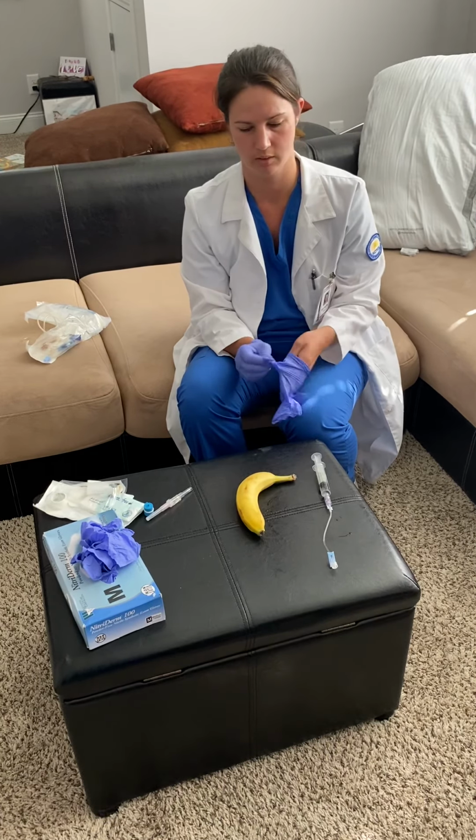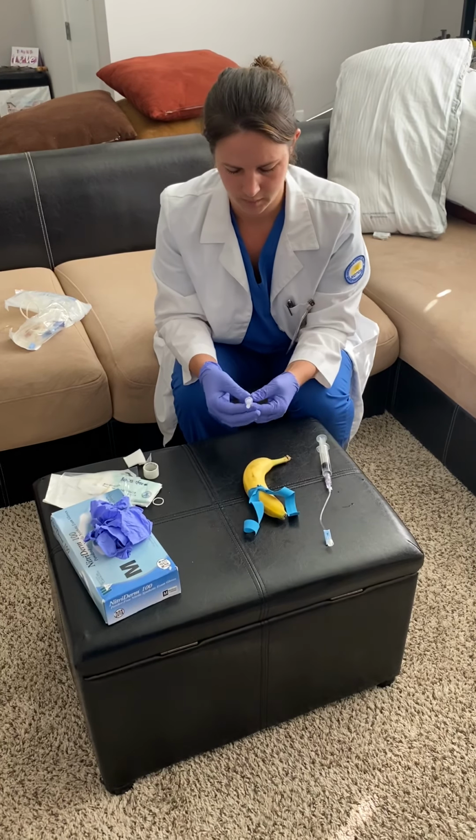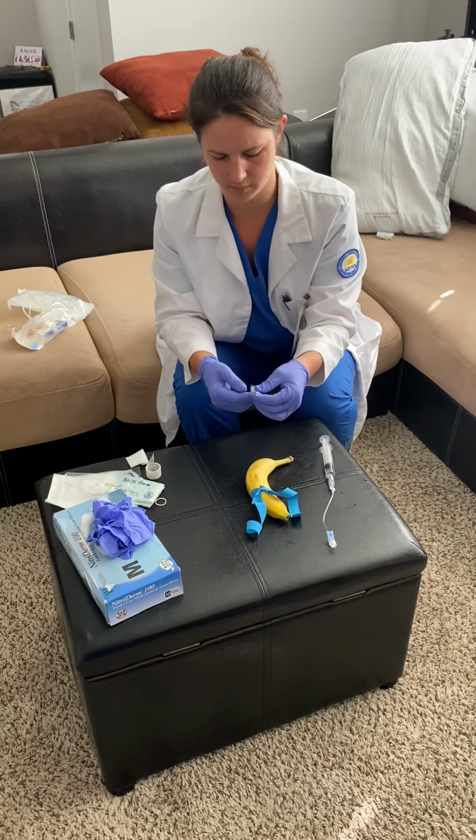And I've already made sure that they don't have any allergies to any skin prep. So I'm going to move outward in a circular motion. And then reapply the tourniquet. Make sure that that dries. And you're going to take your catheter here, making sure that the bevel is up.